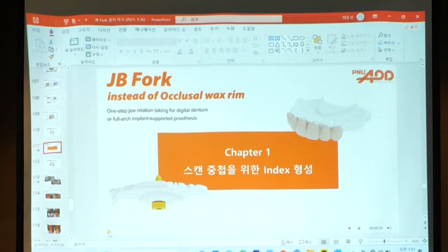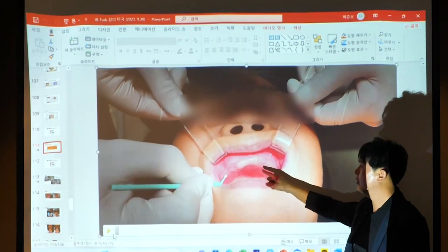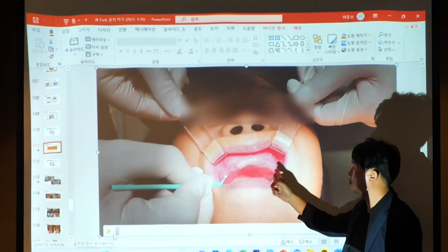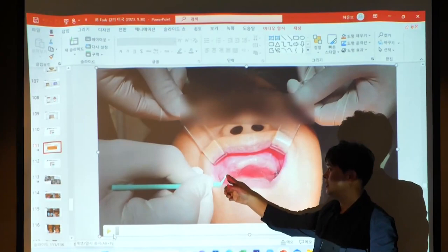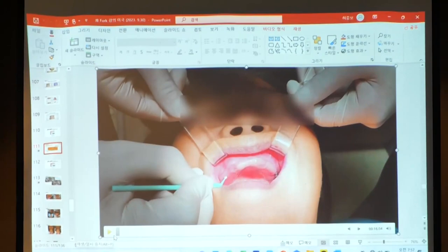So this is a very important procedure. This patient didn't have any irregularity in the alveolar ridge. But in that case, we have to make reference points. So very simply, first of all, you have learned about the dentin bonding system in the morning, right? So anyway, any adhesive is possible. Adhesive is added slightly at this point. So let's continue to see this video.